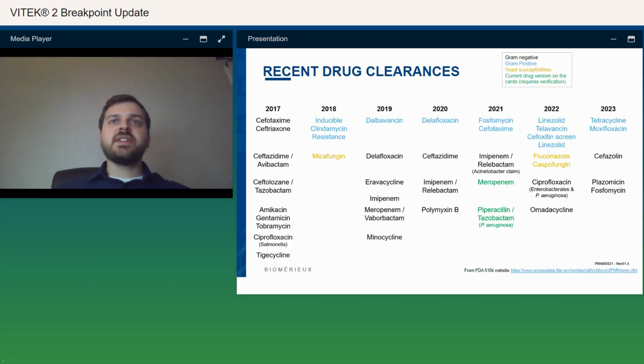And this next slide may seem familiar if you've attended some of these other sessions, but as part of our continuous effort to meet market demands and adjust breakpoint changes by FDA and CLSI, bioMérieux is always submitting new antimicrobials or new formulations of existing antimicrobials to FDA for approval, just to make sure we can offer those antimicrobials to our customers, the ones that they need, and to make sure that those antimicrobials are able to accommodate the newest breakpoints. So sometime after submission, bioMérieux gains FDA approval. However, new antimicrobial offerings or new formulations of an antimicrobial won't already exist and can't appear on an existing VITEK 2 card until after they've received that approval. So of course, we'll need to, after that fact, introduce new cards, including those antimicrobials.